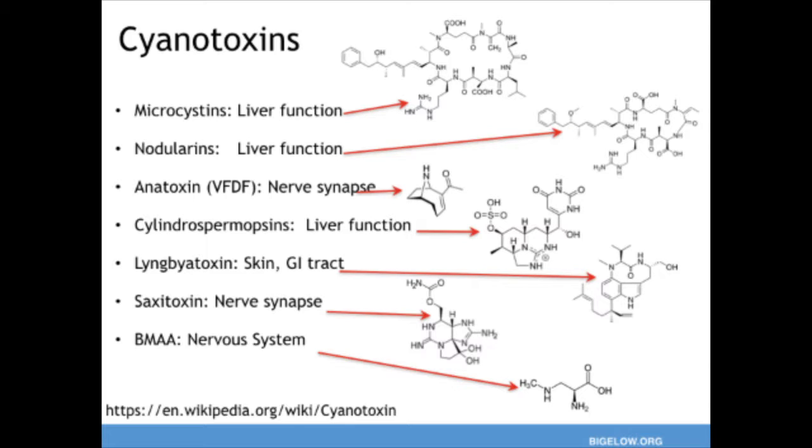And this is one that produces the red tides that we have to deal with in the marine system here. So we're actually set up down at Bigelow to monitor for this and perform an FDA certified method for that.